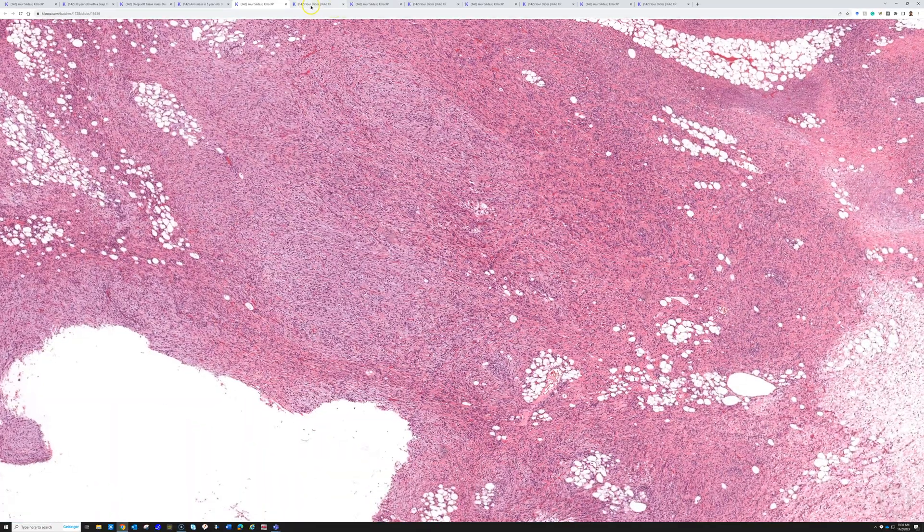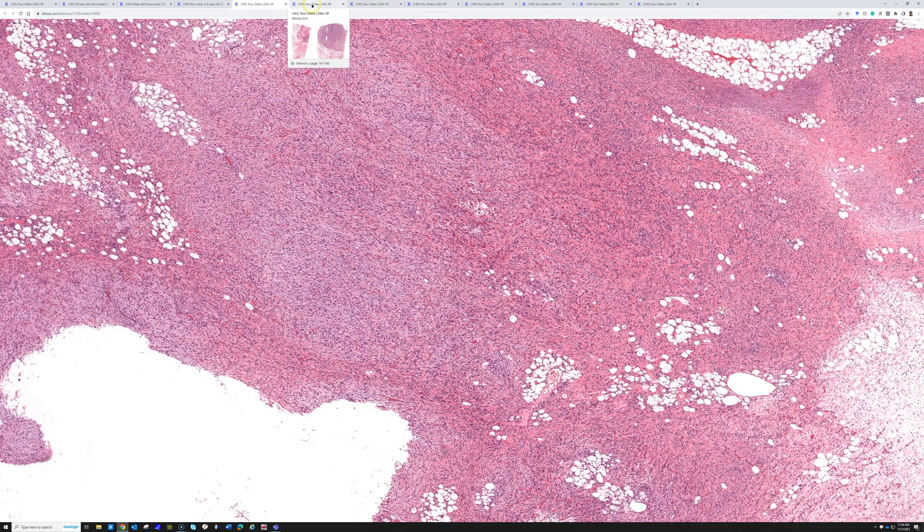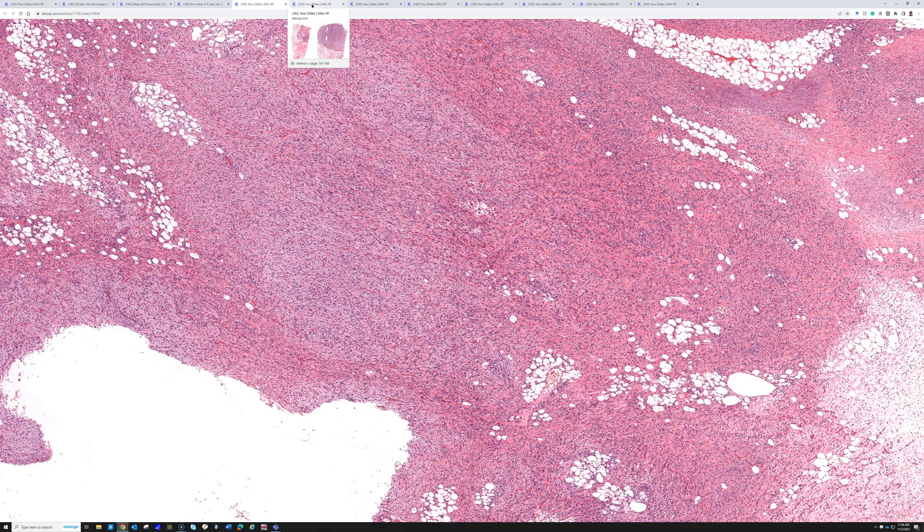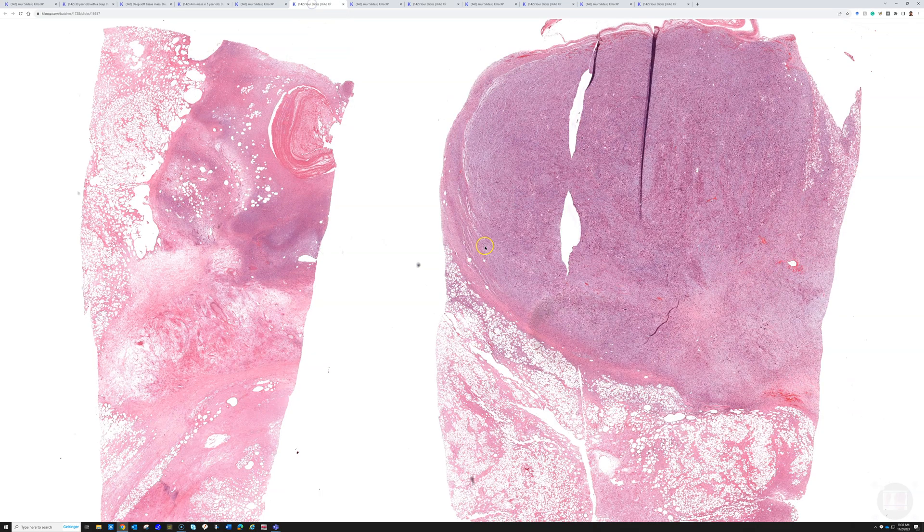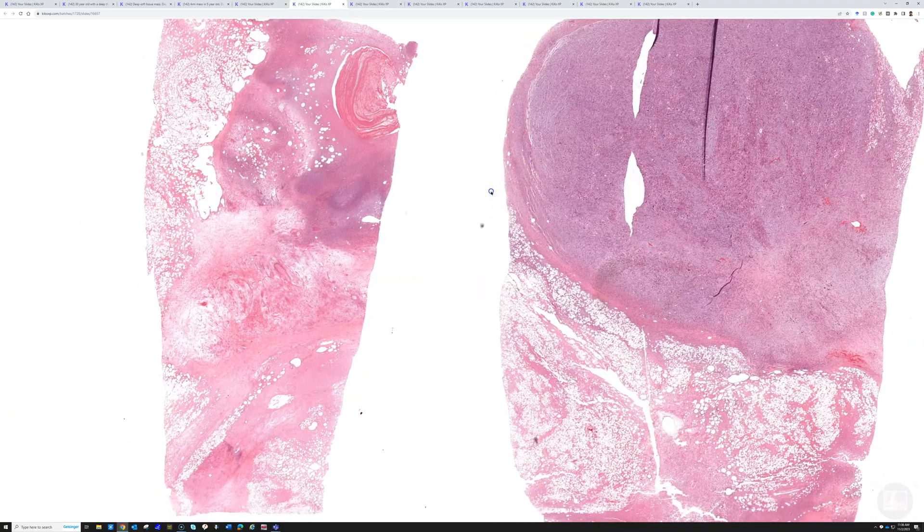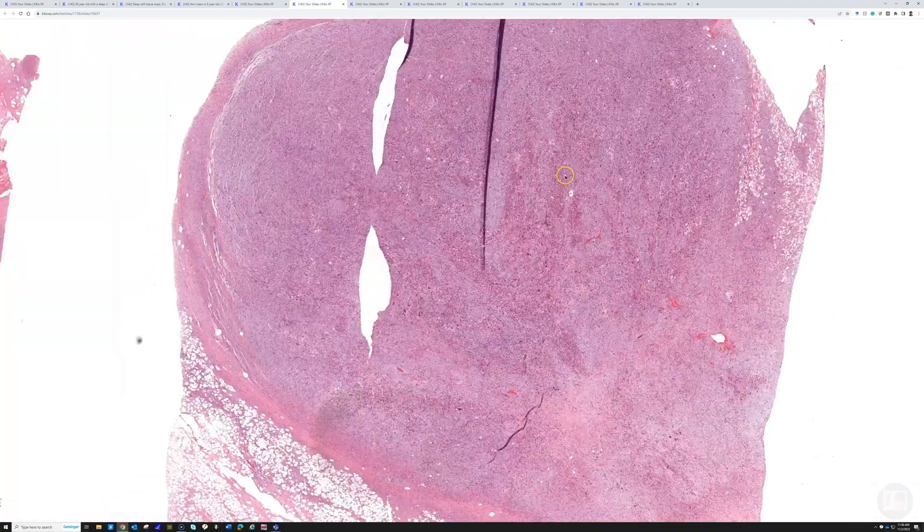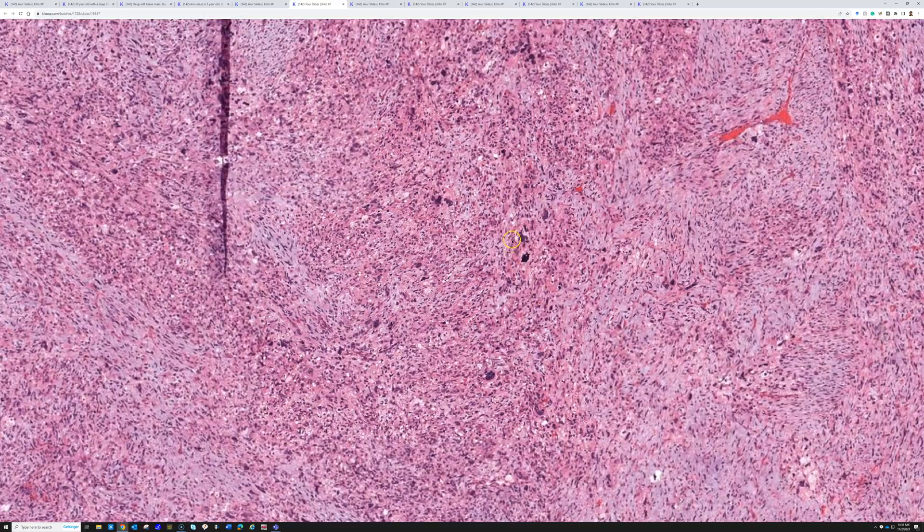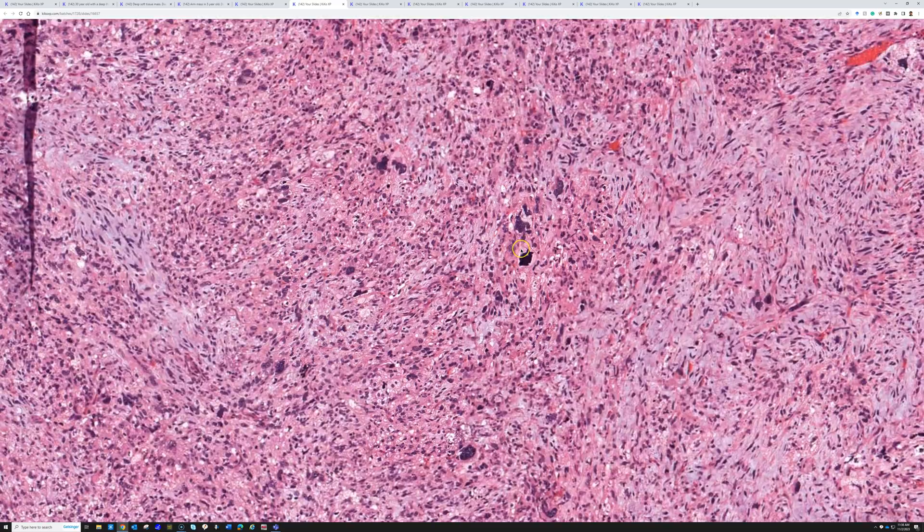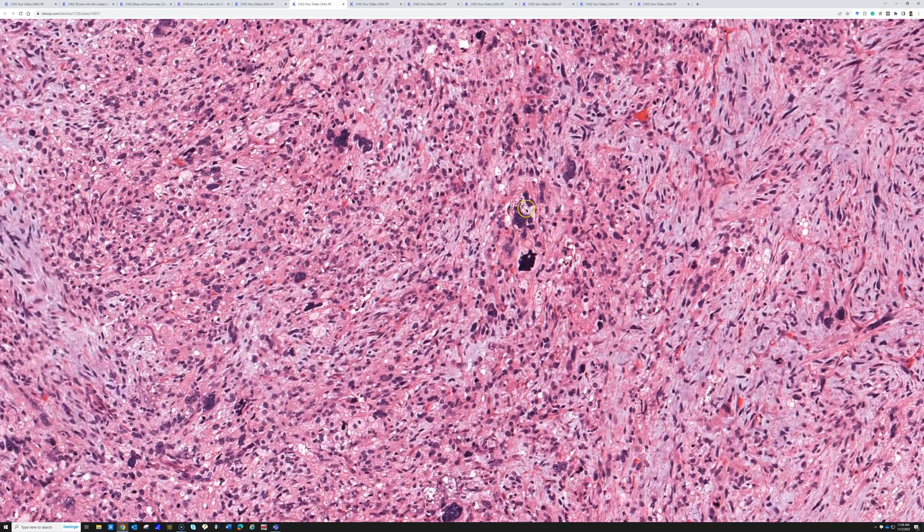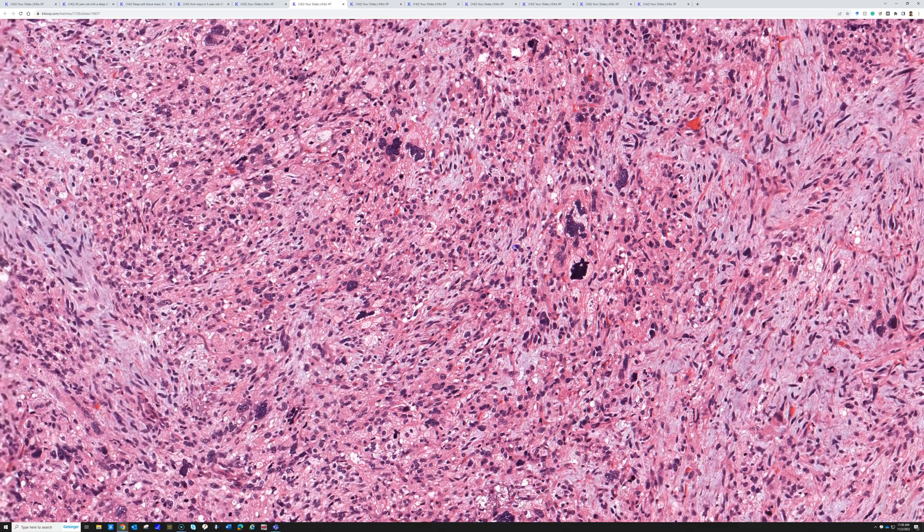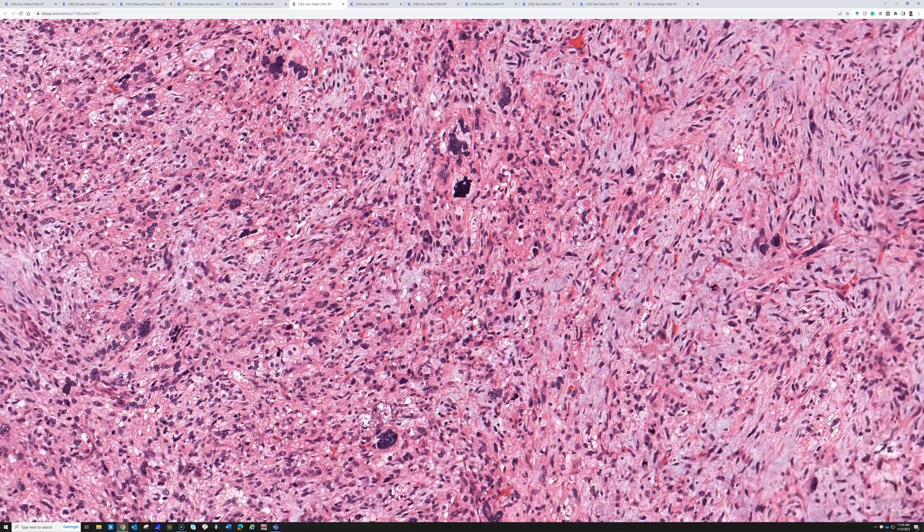Let me show you a different slide, same patient, same tumor, just a different section. In this area, we have dramatic pleomorphism and bizarre pleomorphic lipoblasts, with that myxoid background.